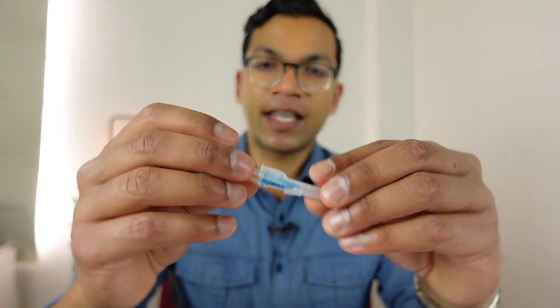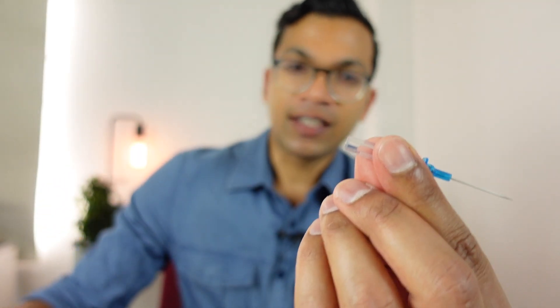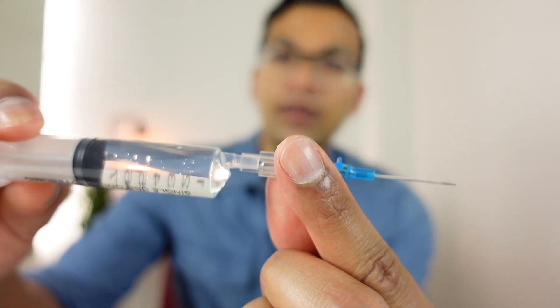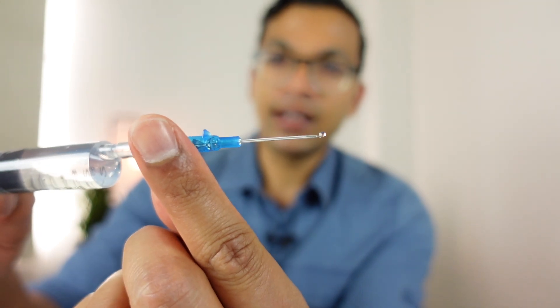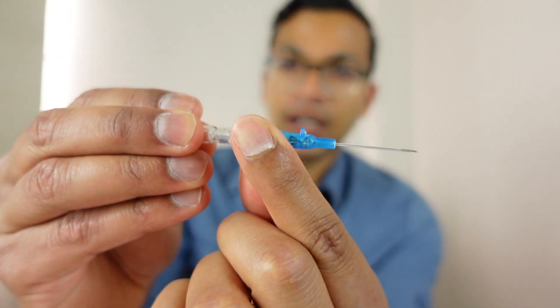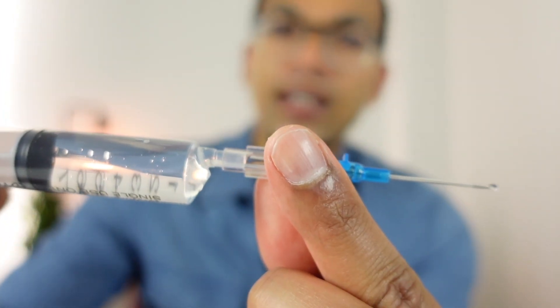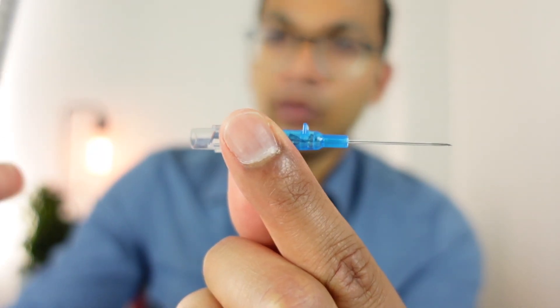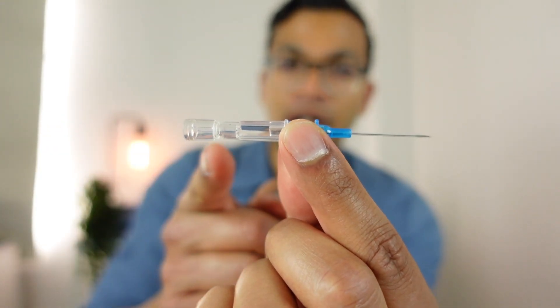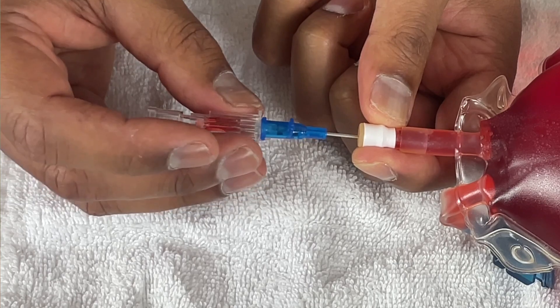In the second scenario, I take my cannula and uncap it as normal, then take off this little device here. I take a syringe of saline and simply put saline into that chamber until it drips out the other side. Now that whole needle column is filled with saline. I remove my syringe and recap it cleanly. Now I've got a cannula with a saline fluid column throughout the whole needle and into the chamber. As I enter the vein, you'll see a different quality to the flashback - it kind of squirts out the other side.